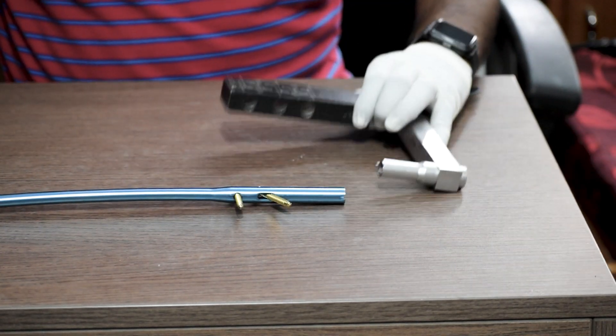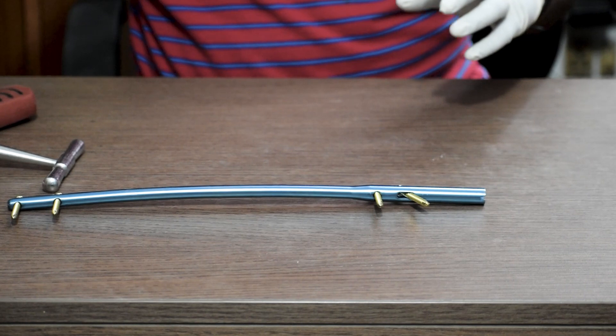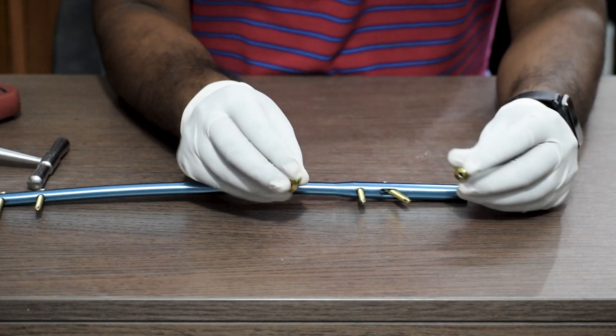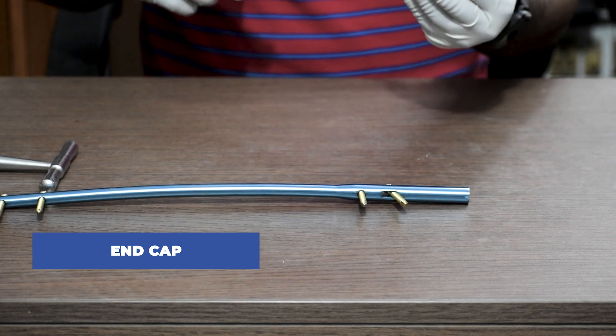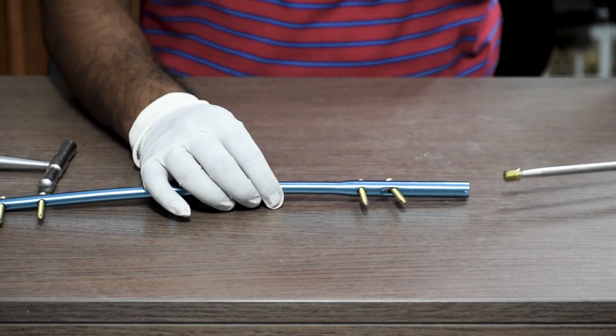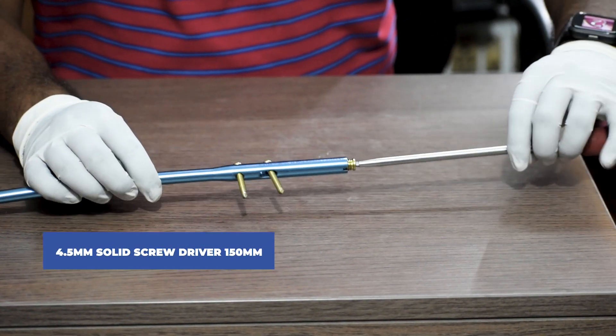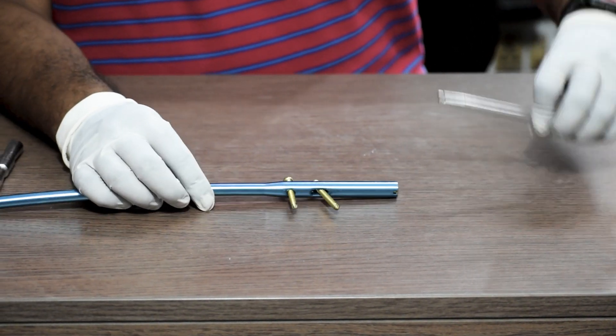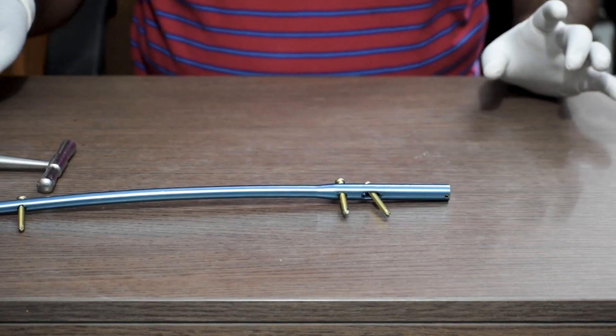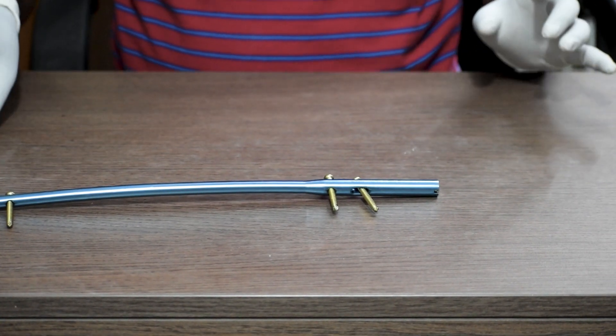Once we have removed the jig, we will fix either a 0 mm or a 5 mm end cap depending upon the position of the nail, and we will use a 4.5 mm solid screwdriver to fix the end cap. You can check the previous video to understand more about the end cap.